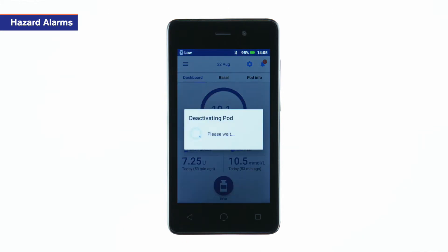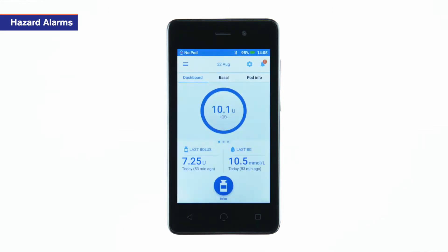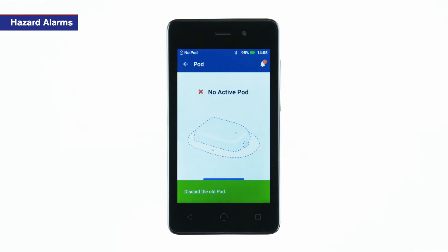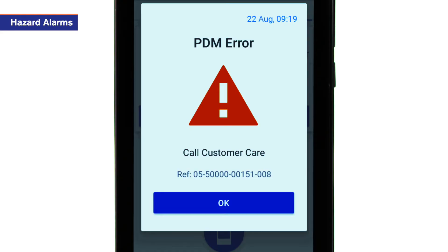In many cases, this deactivates the pod, and you can then activate a new pod. Some hazard alarms prompt you to call customer care.